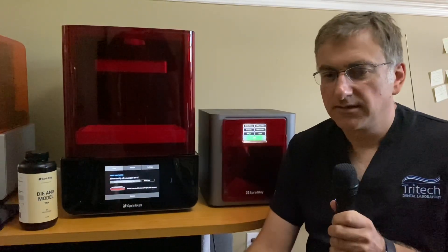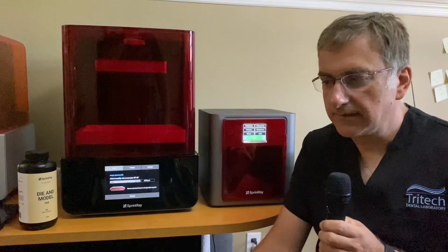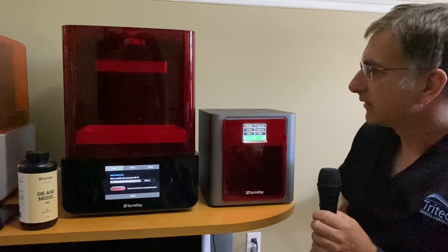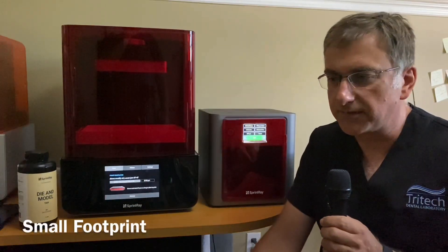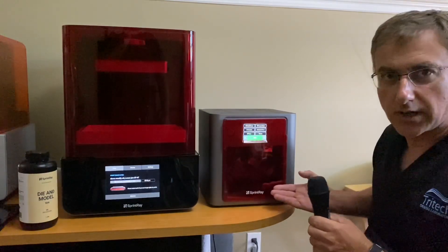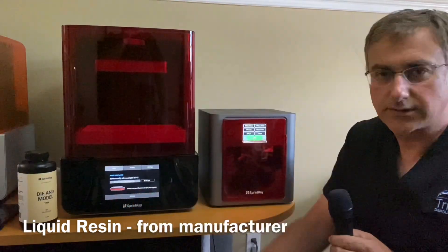Thanks Scott. What you see here today is the latest Sprintray printer that's been out for a little while in the market, and it's a remarkable addition to our production here. As you can see, it's very easy to put anywhere in your lab - it can fit anywhere on any desktop, counter, or shelving unit that you have. It comes with the printer and the light box.